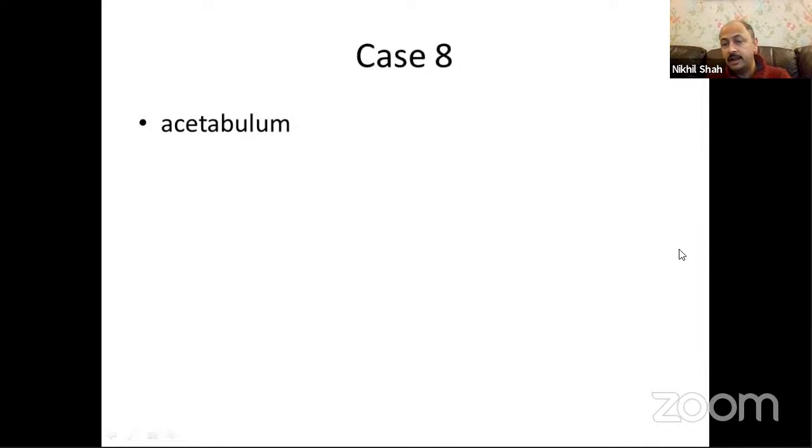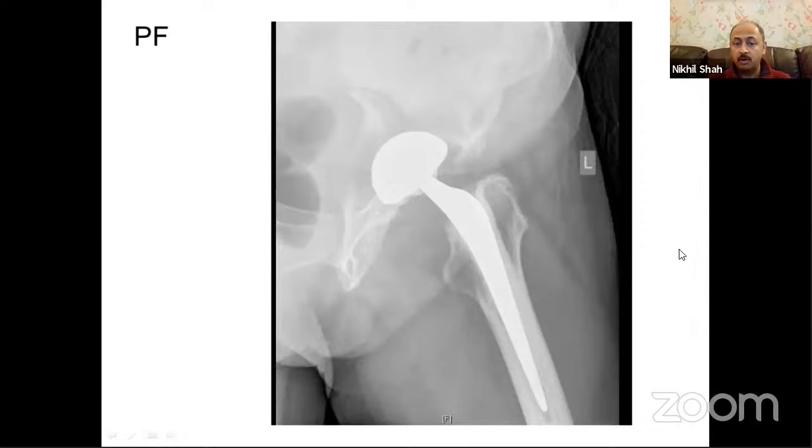So these generally tend to come to us because we are also the regional pelvic and acetabular unit, and that's really my main focus of my practice. So I've just got one case as an example, just for people to refresh the principles, because we covered this extensively in the last conclave meeting in pelvic discontinuity. So this was a traumatic fracture of the acetabulum. And you can see that both the columns are involved. It's a transverse type fracture of configuration and fairly displaced.